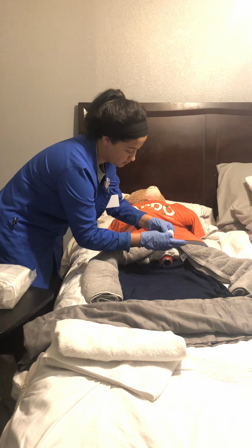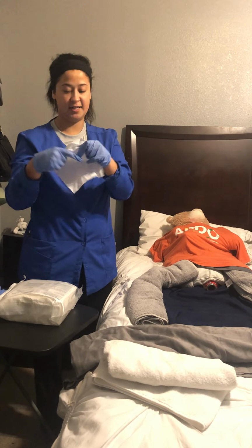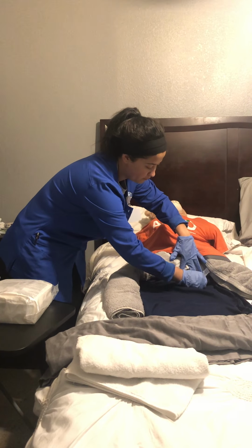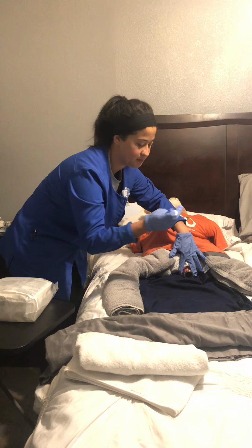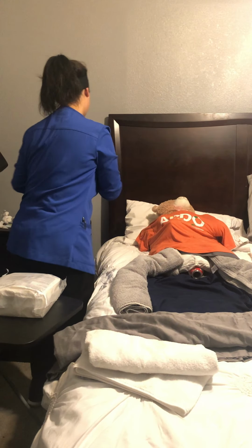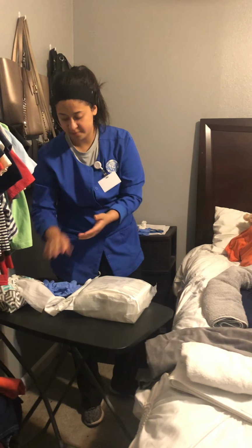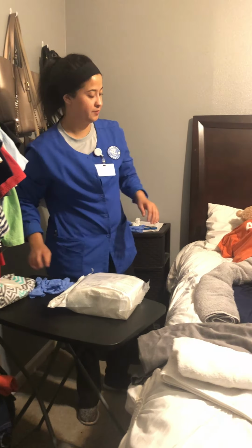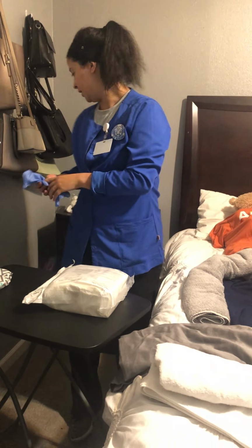Let me start over. I'd get a towel with soap and water. I would just wipe the labia furthest away from me, change my towel's position, wipe the other labia, change my towel's position, and down the middle. I'm going to dispose of my gloves, and I would perform hand hygiene again. Not miss those labia. So once I do that, I am ready to open my catheter.